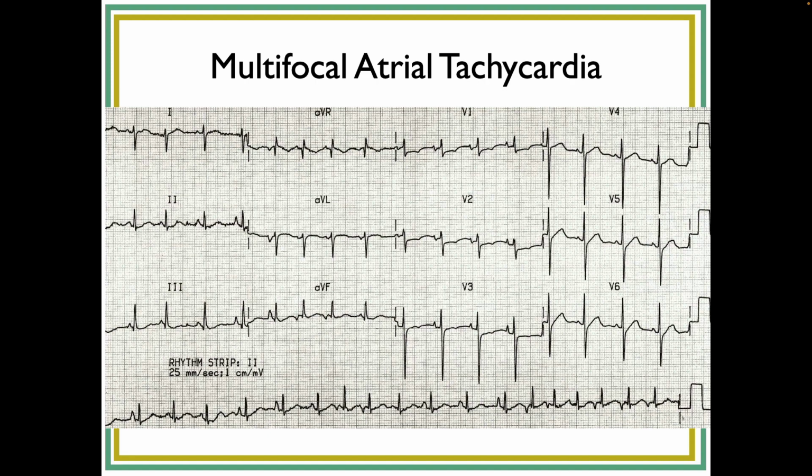Here's some more. This is all the same. Well, this is the 12 lead. So if you look across the bottom, you'll see how it changes. This one is pretty fast. What is it? It's about 130, 140.